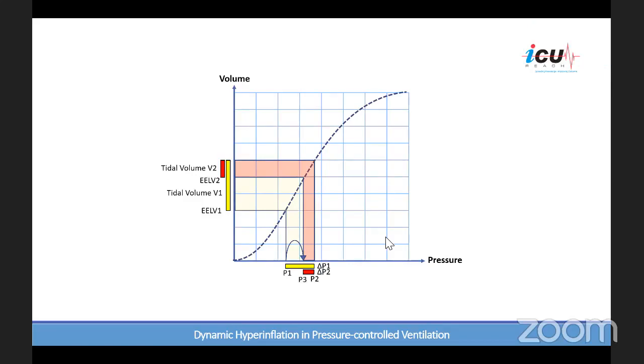Is changing to a larger ET tube helpful? Well, it is helpful in a way that you minimize the added airway resistance. The tube has its own resistance.